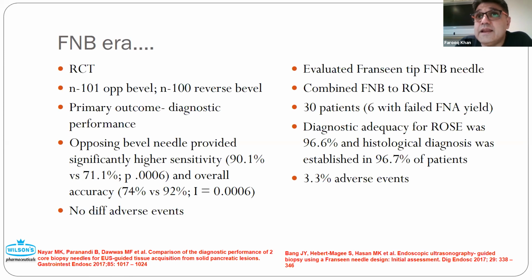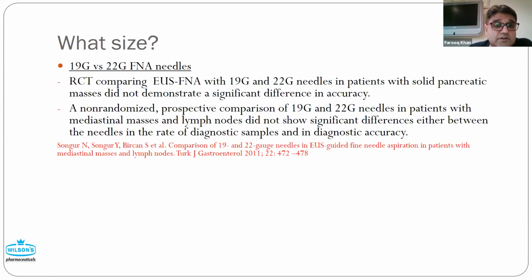And since then, the 2017 ESGE guidelines came along, and they changed their recommendation to FNB needle. As I said, for solid lesions, it's very rare that I ask for FNA. We all now use FNB needles. Whichever you've got in your department, I'd encourage you to use that.